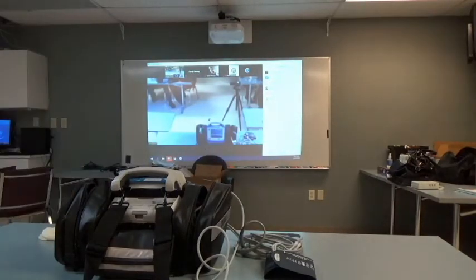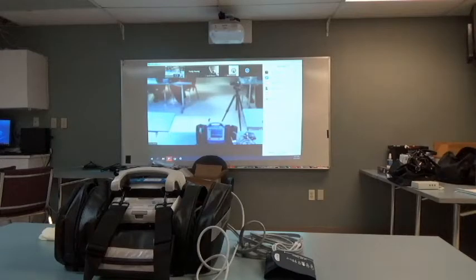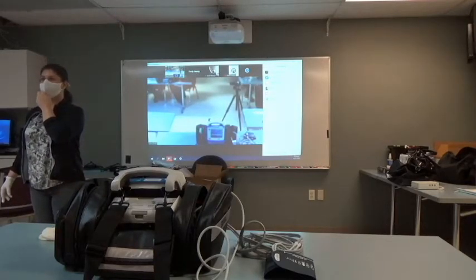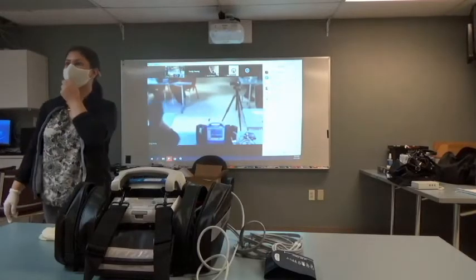Did everybody get that? The camera symbol is your record button. If you look down at the bottom, you're going to see the camera symbol. Then you get 12 seconds before and 12 seconds after. So it's your Back to the Future and your record button. That'll give you a 24-second strip. Any questions? Everybody doing good? Do you guys have any questions for me about any of the buttons on the right-hand side?